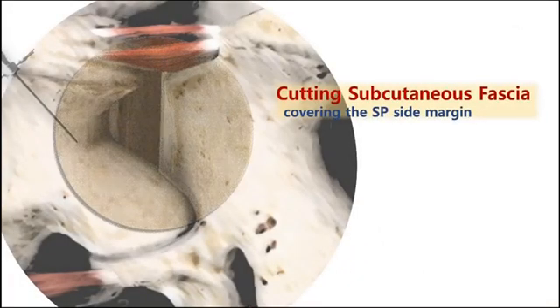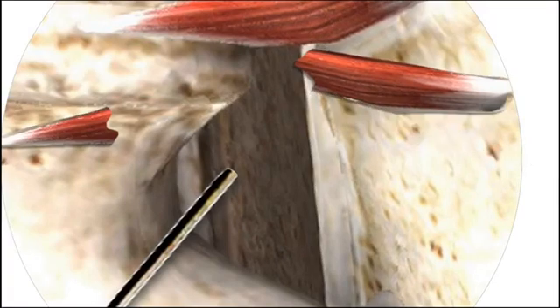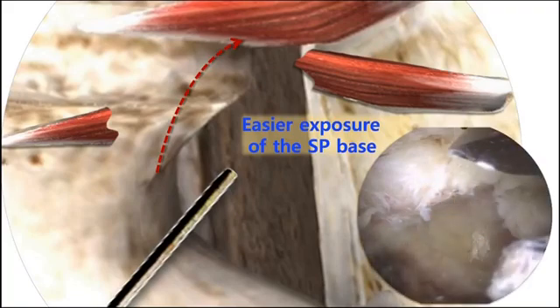Now I summarize the step once again. Cut the fascia medially and touch the SP base bony margin forcefully. Cut the fascia definitely and check the feeling of fascia release. It shows the SP base well in a wider view and you can move to the next step to resect the SP base. This first step is the very important one deciding whether your procedure is easier or tough and harder.